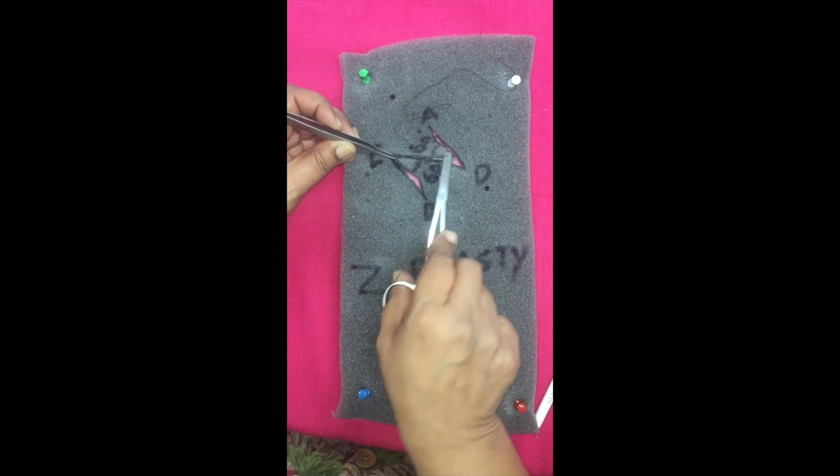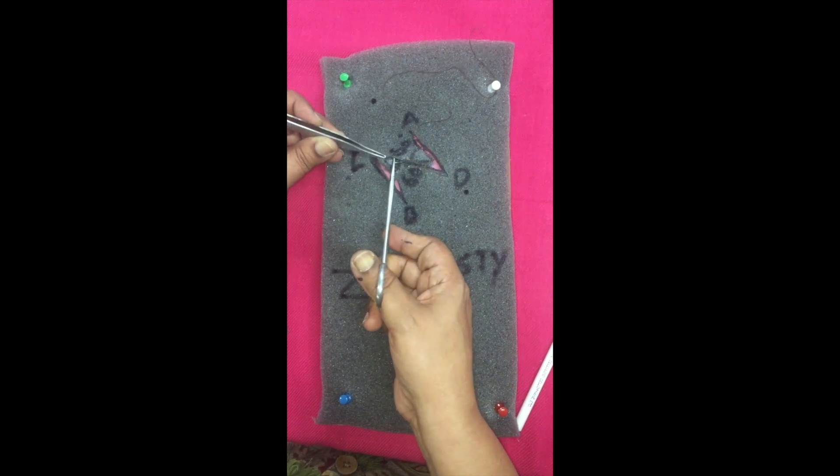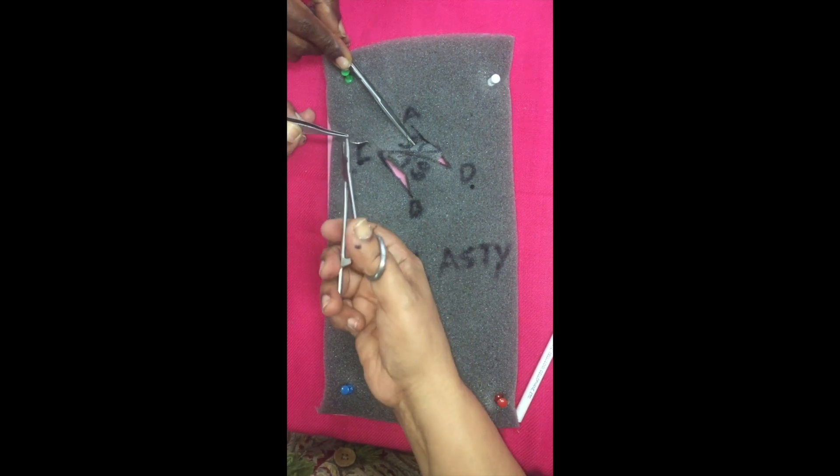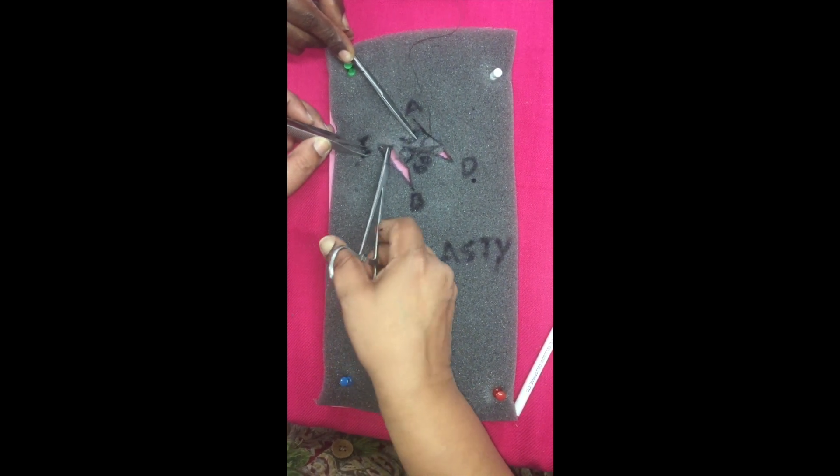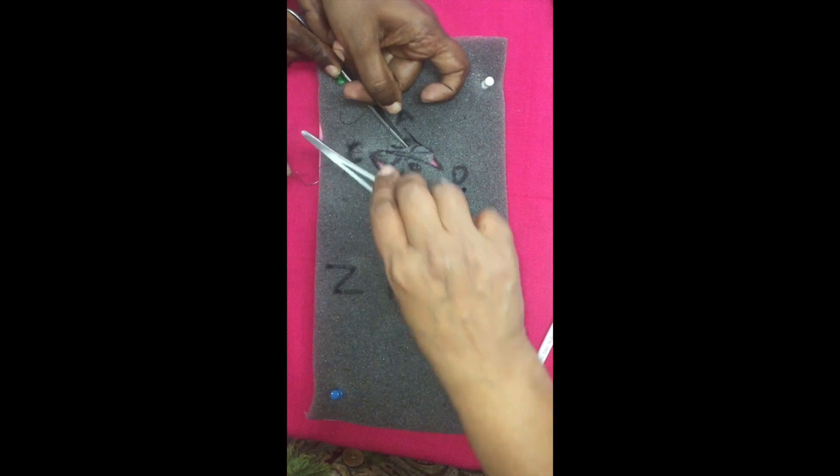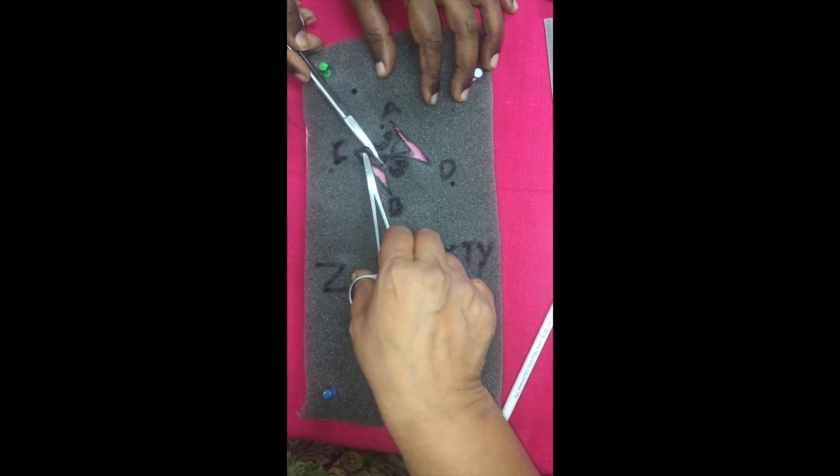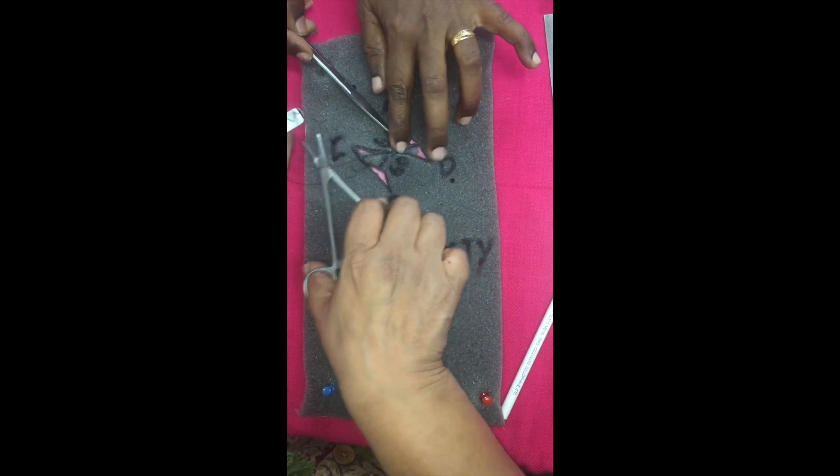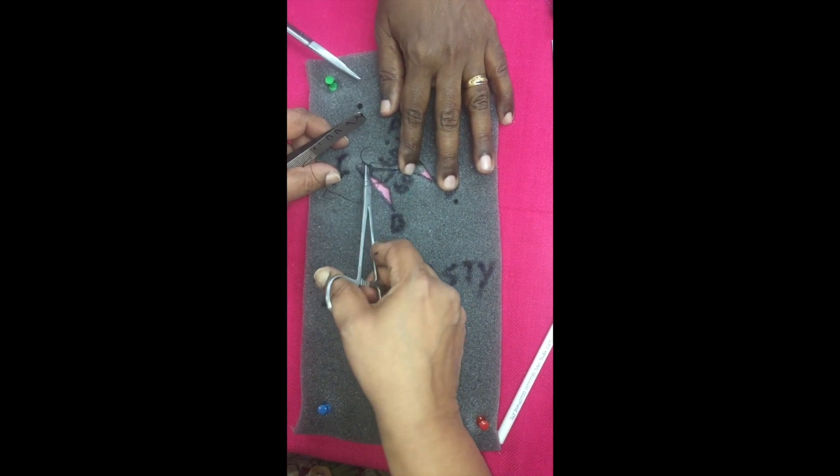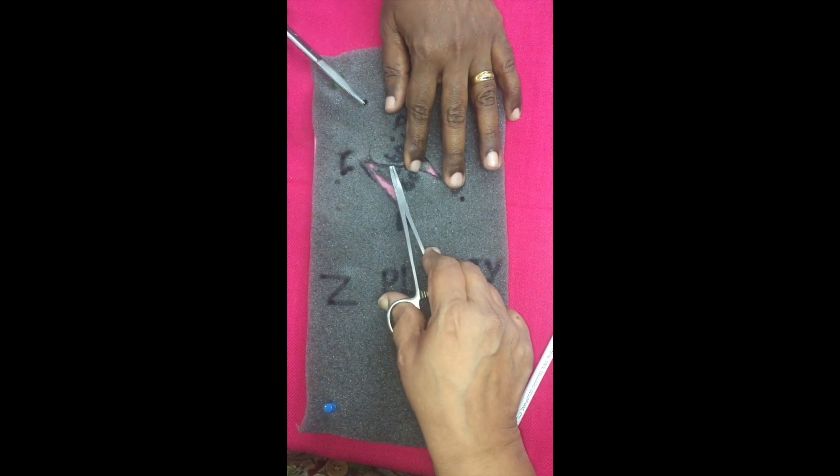Once you transpose them, you need to suture the flaps. Here, since we are not able to put a three-point stitch, being sponge, which is not holding the three-point subdermal suture, but generally in tissues, in clinical practice, we use three-point transition stitches of the angle, to secure the angle. After the flaps have transposed, just apply the stitch there, at that point.